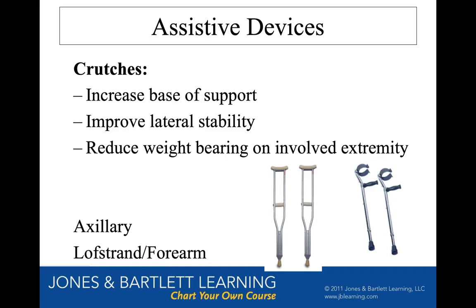He wasn't leaning back on a posterior walker. He was able to walk better with Lofstrand crutches, and they were always attached to him. He could reach up for a bookshelf. He could carry his backpack, and he could swing his backpack on and off his shoulders without his crutches falling to the floor. So they worked really good for him.